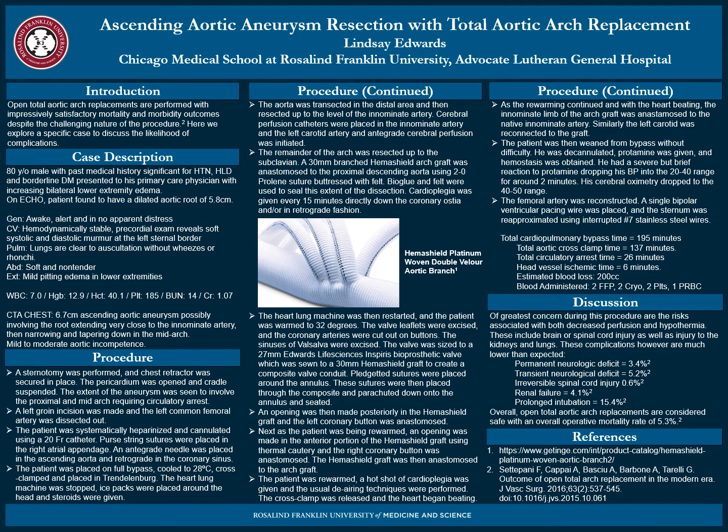Total cardiopulmonary bypass time was 195 minutes. Total aortic cross-clamp time was 137 minutes. Total circulatory arrest time was 26 minutes. Head vessel ischemic time was 6 minutes. Estimated blood loss was 200 cc's.